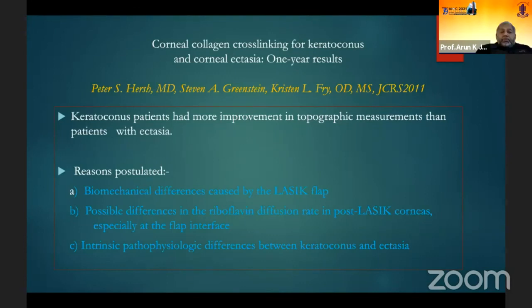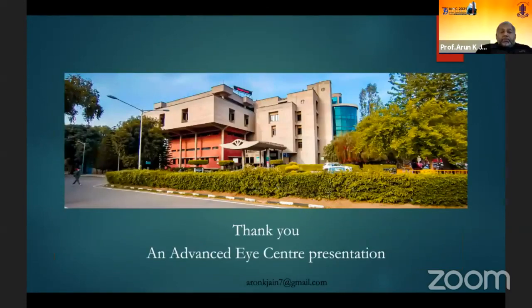So basically speaking, there is practically no difference in the way we do C3R. We follow the same guideline as you would follow with a thin cornea or with normal corneal thickness, but probably the result may not be as good in a post-LASIK eye as in the virgin eye.